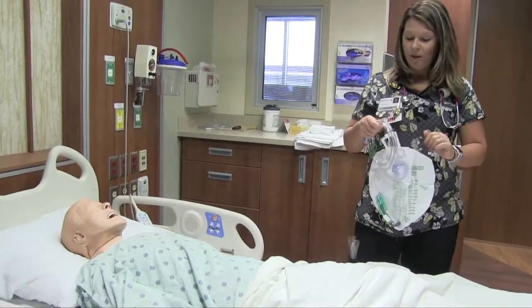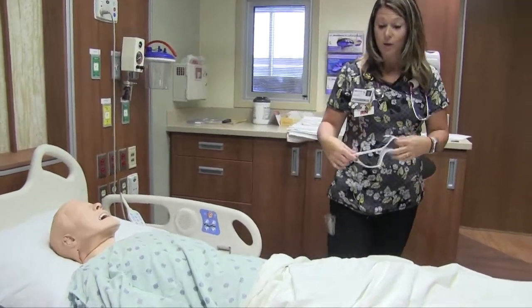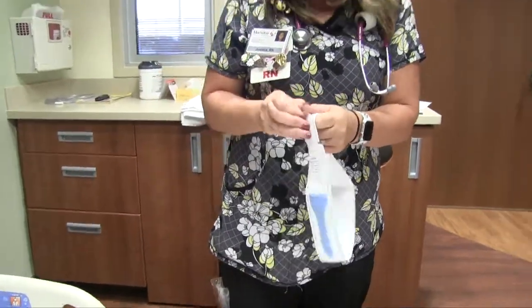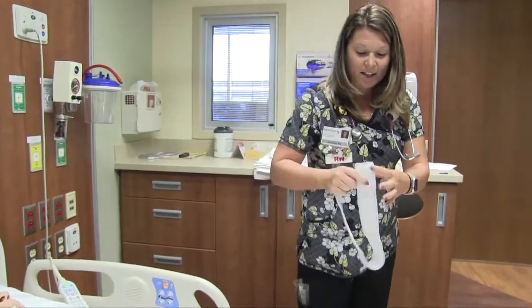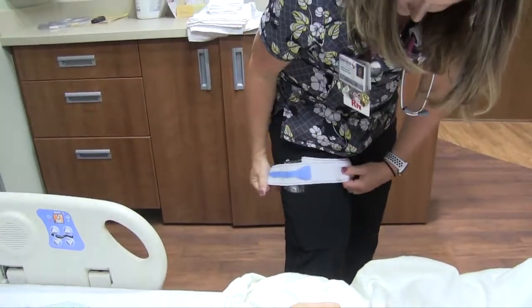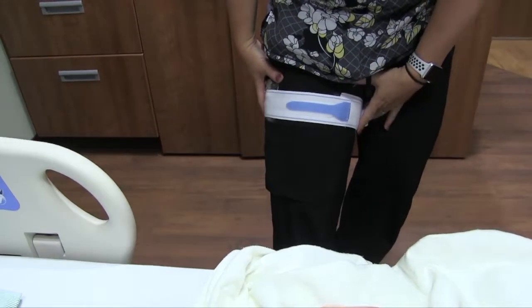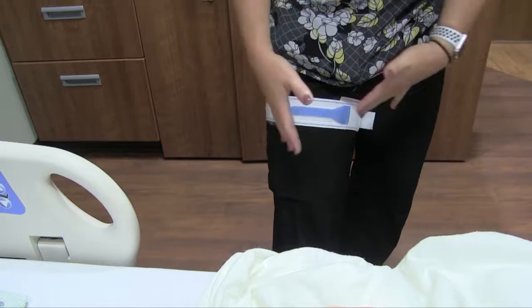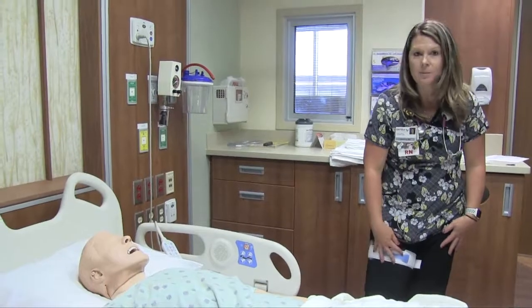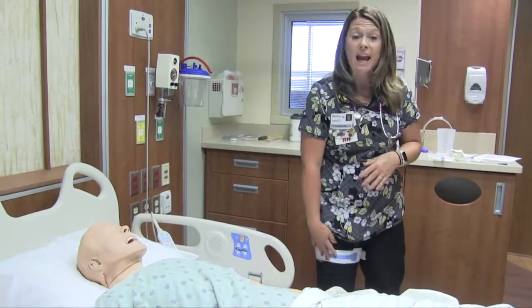Okay? Good with that? So we also secure this bag on your leg. You have a leg strap on now, but I'm going to show you on my leg how this works, and that it's pretty easy to take care of by yourself, Mr. Smith. So the strap is going to go right above your thigh, right in this area. Every day you need to switch spots of the strap so that you don't get any sores, and it also moves the catheter around, helps with the drainage, and helps decrease the soreness that you might experience while you have that catheter in place.